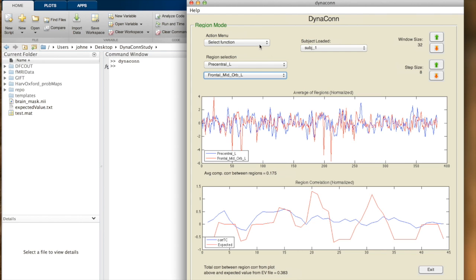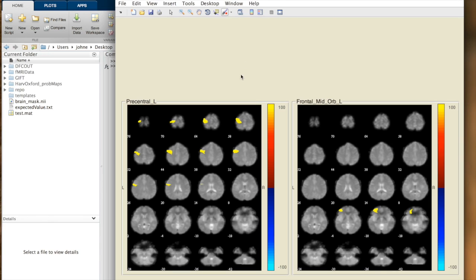In this case the component display doesn't mean as much because by definition we already know where the data will be for a particular region, because we're selecting the regions, and these regions are defined by the brain atlas that we selected. But it is a useful tool for understanding where a particular brain region is in the brain.